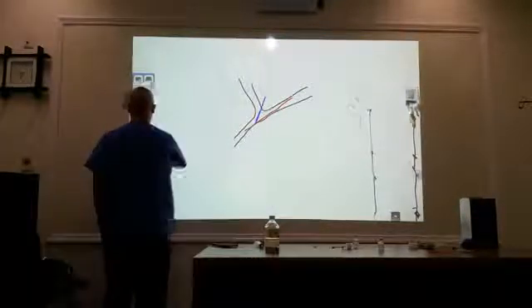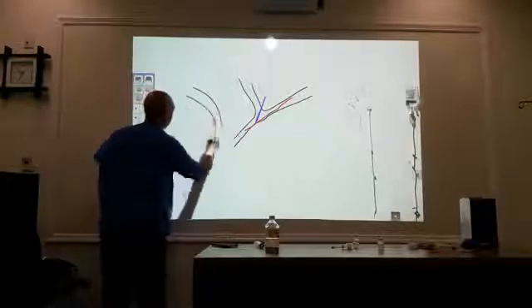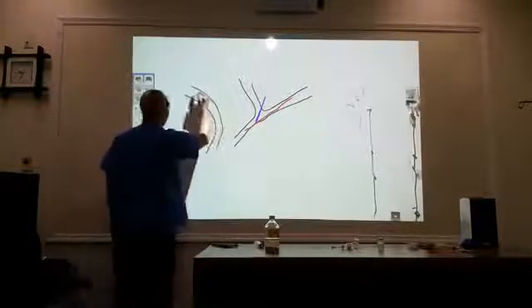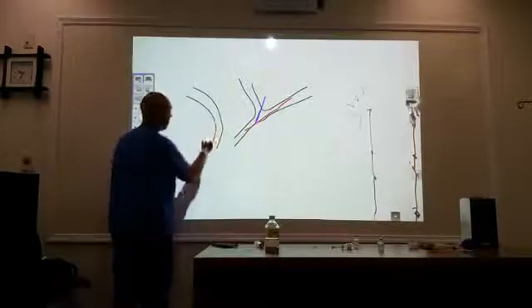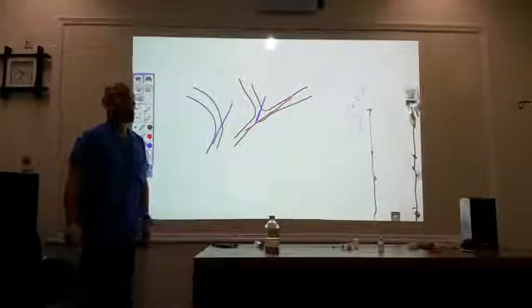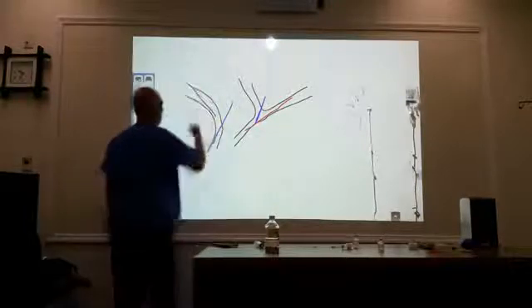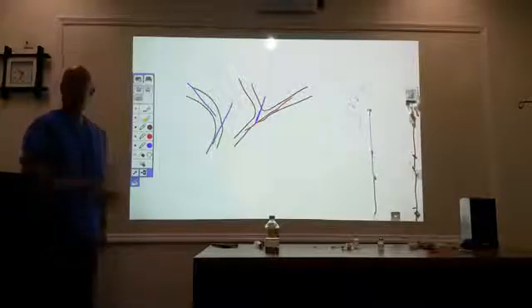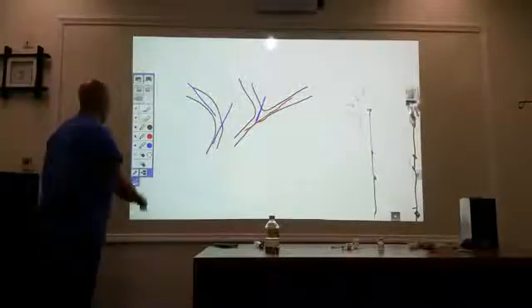If you have a curve, I'm going to stick here and not here. If I stick here, it goes right through the vein. If I stick here, it can be accommodated. Okay? Makes sense? All right.